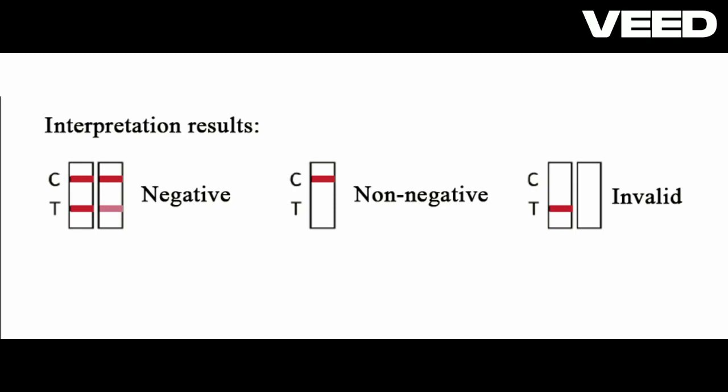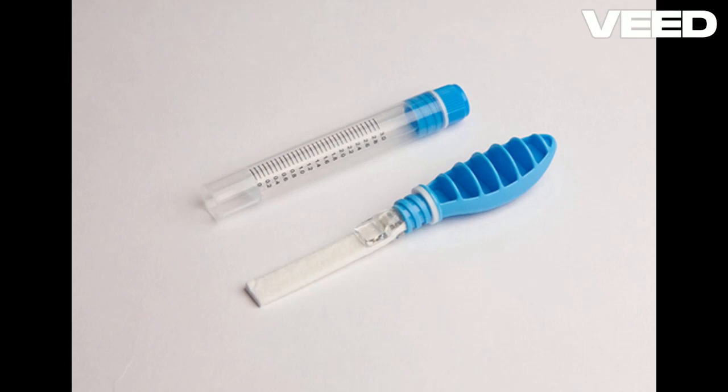To confirm this non-negative result, a second sample should be sent to an accredited lab, unless of course the donor then changes his consented donor form information and admits drug use. The presence of alcohol is a simple color change, with no control or test lines present. The pad, which is initially white, develops a green coloration if alcohol is present. Upon completion, please dispose of the cube carefully.